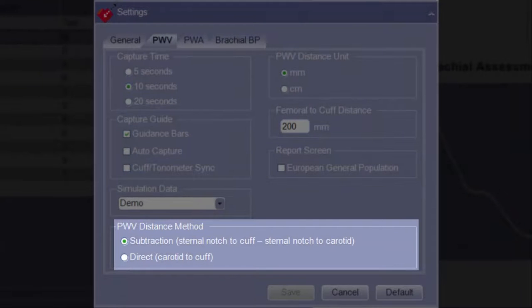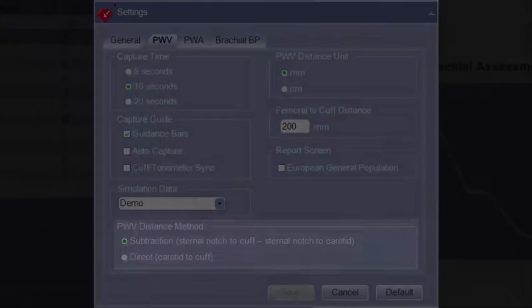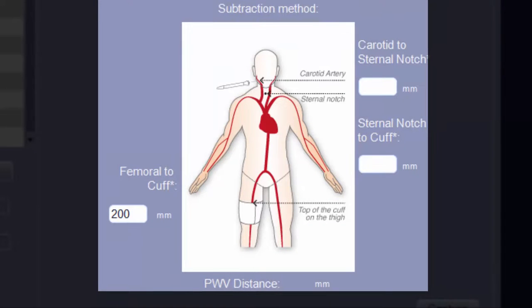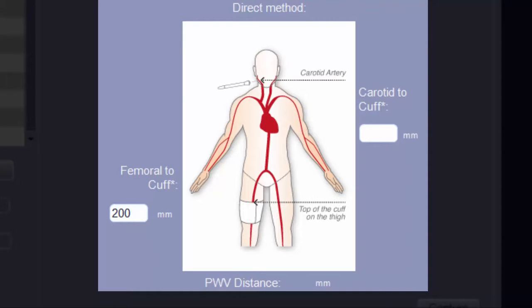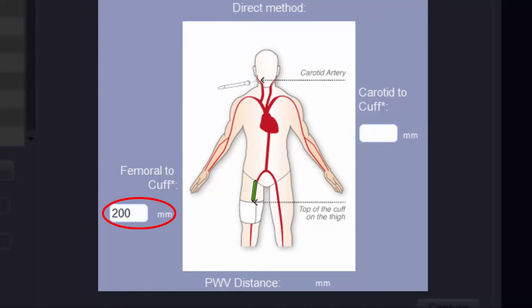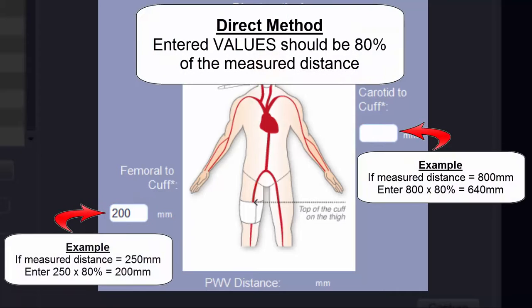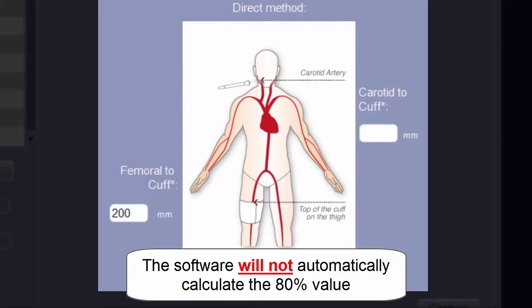Under PWV Distance Method, there are two options for distance input. The Subtraction Method requires measurements from the carotid artery to the suprasternal notch, from the suprasternal notch to the thigh cuff, and finally from the femoral artery to the thigh cuff. The Direct Method only requires a measurement from the carotid artery directly to the thigh cuff and from the femoral artery to the thigh cuff. It is recommended when using the Direct Method that the entered distances equal 80% of the measured value, as this coincides with current professional societal recommendations. The software will not automatically calculate or apply the 80% value.